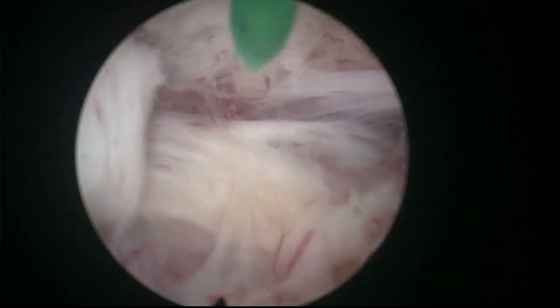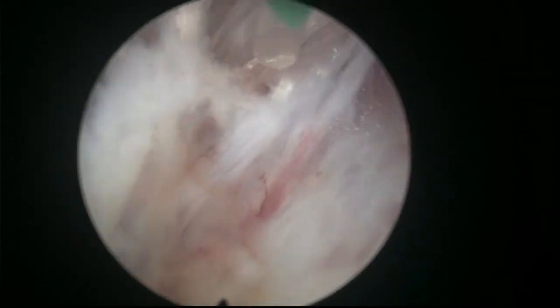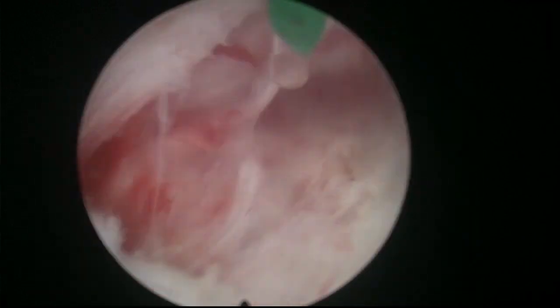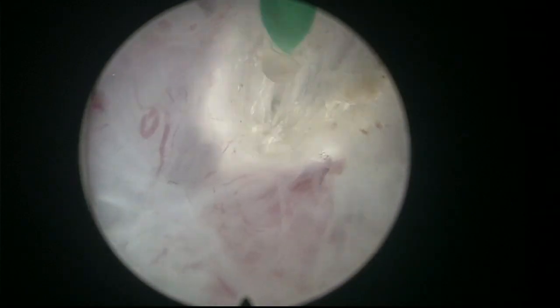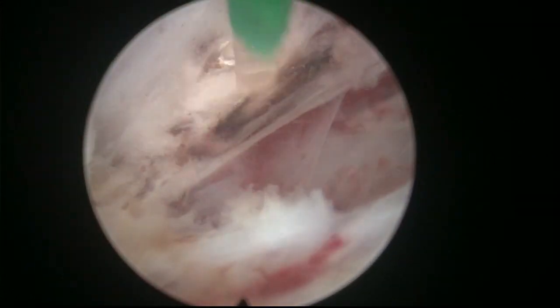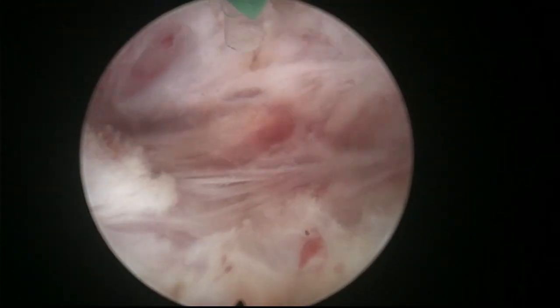Sometimes a piece of tissue can get in the way and block the visibility a little bit, but just don't pay too much attention to that. If you're following the right angle, the right curve, even when you momentarily don't see, you can confidently continue working. Of course, if you cannot see for a long time, you should be careful and try to get better visibility. That's the light cable that went off. Let's go again. And now I'm trying to dissect a little bit of the anterior plane. There's the vessel there.